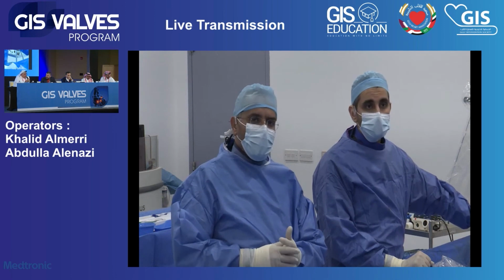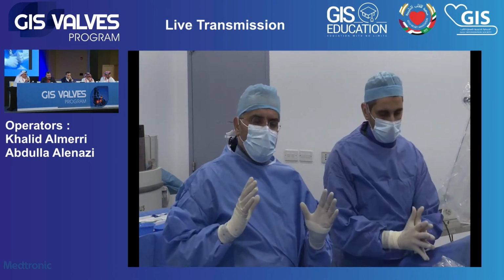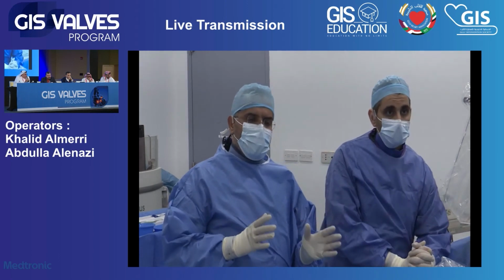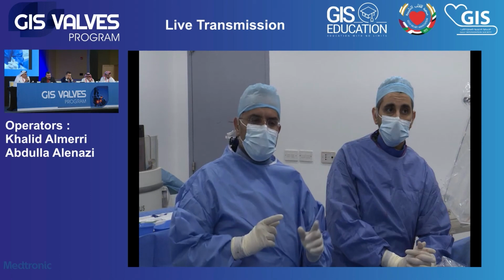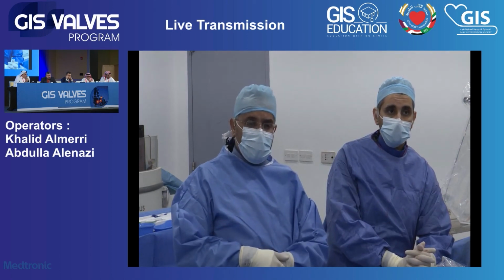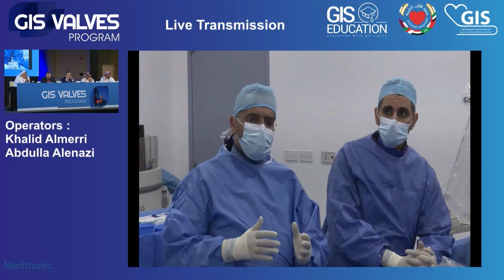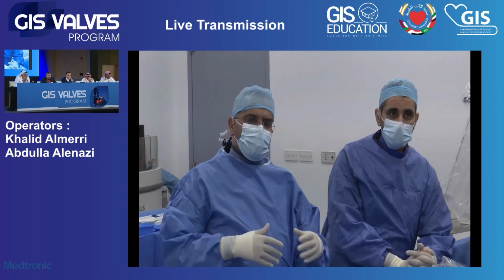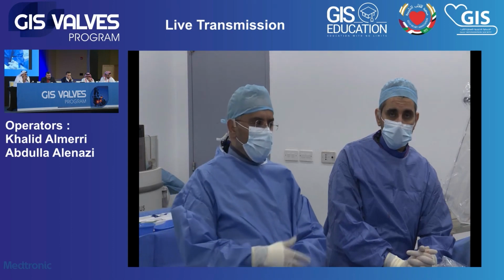We have one comment before you go. If you have a single leaflet mechanical valve, it's usually bigger, as you said, and it's more challenging. The risk with that is higher. Bi-leaflet valves have less risk compared to the single leaflet. Yes, that's true. And we're lucky this lady has a St. Jude valve.